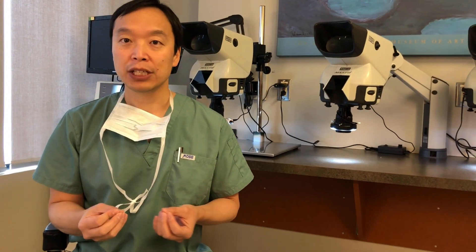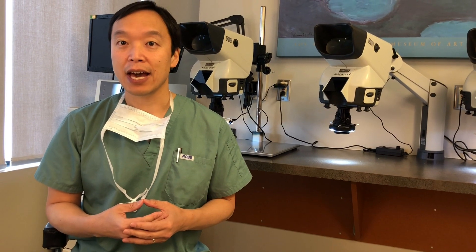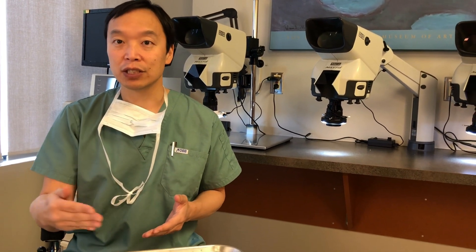Hi, this is Dr. Nakatsui. I just wanted to go through some of the FUE punches that we use for doing FUE. These have changed over the years and we've kind of evolved as the years have gone by.